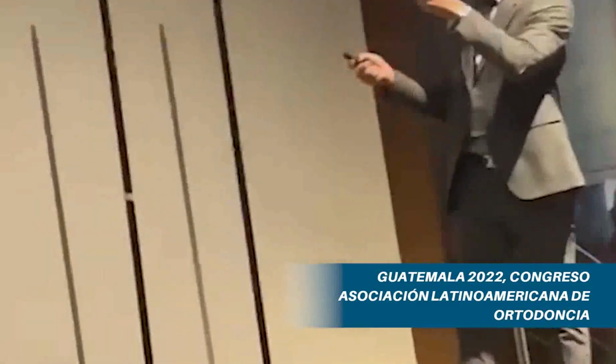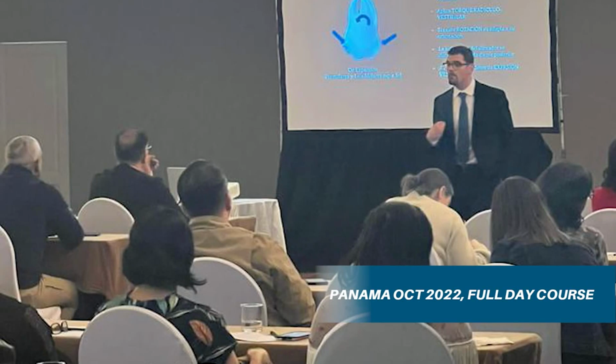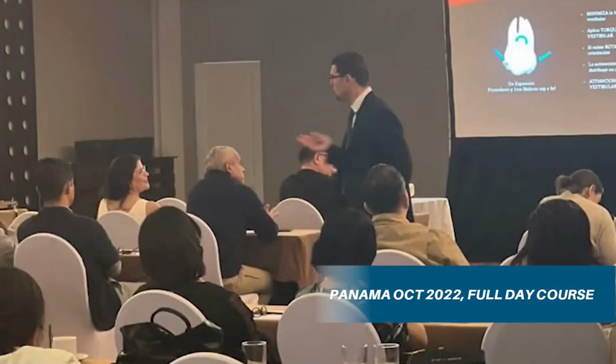The segment expansion will only be done if it is the expansion of the second molar. In this case, we place the teeth in position, but since we cannot do the sequence of the movement ourselves, we have to ask the technician for it.